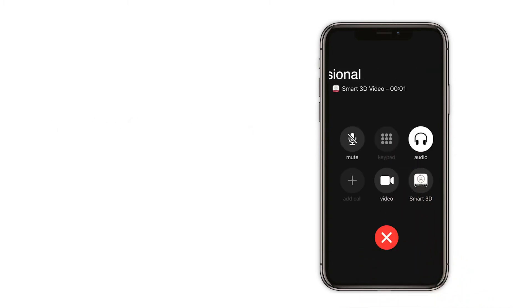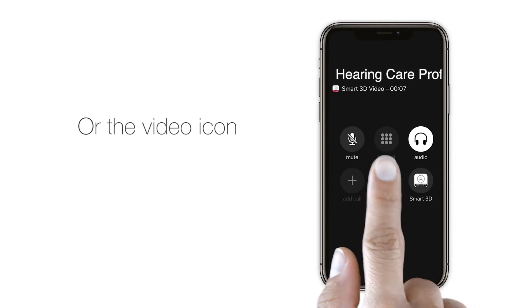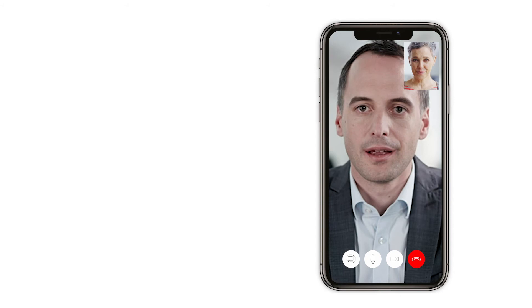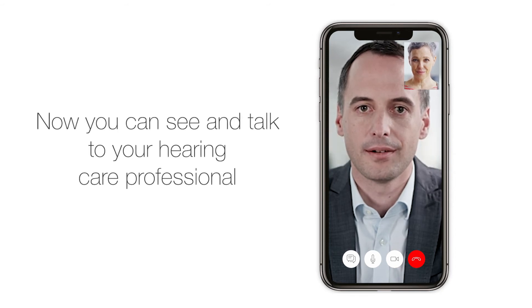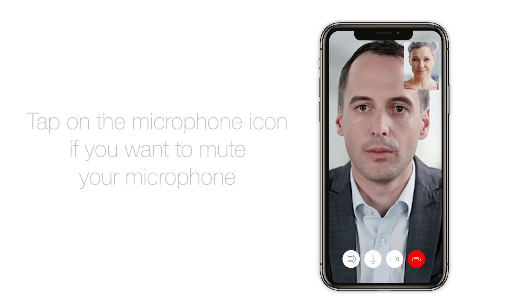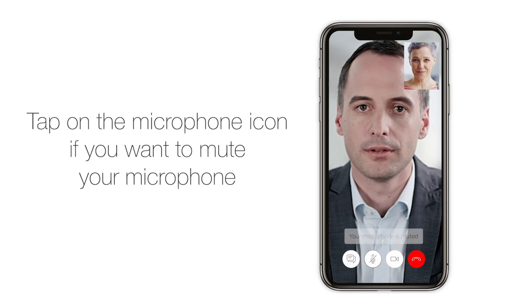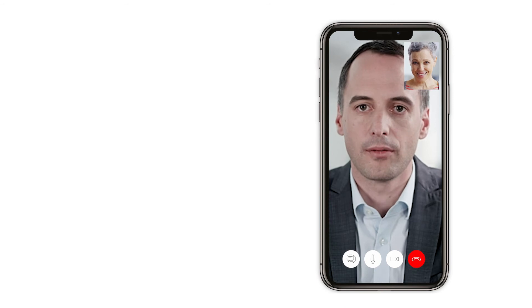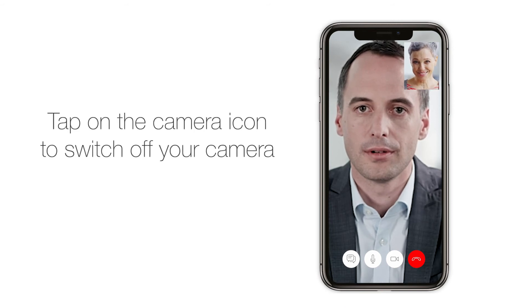Tap the Smart 3D icon or the video icon to enable video access. Be sure to wear your hearing aids, as the sound will be routed directly to them during the call. Now you can see and talk to your hearing care professional. Tap on the microphone icon if you want to mute your microphone, or tap on the camera icon to switch off your camera.